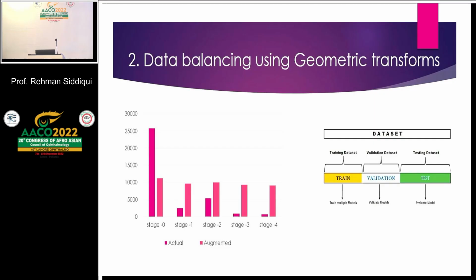Data augmentation techniques are utilized to remove the class imbalance problem because this problem could adversely affect model accuracy. For data augmentation, geometric, photometric, and GAN are widely used techniques. Photometric techniques tend to alter useful color-based features of DR signs, whereas GAN is computationally complex. That is why geometric augmentation techniques are found to be more suitable for this application.